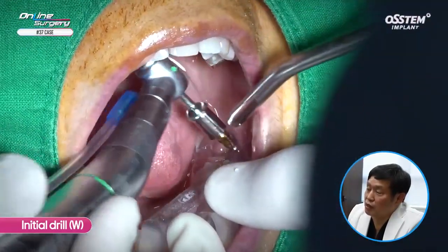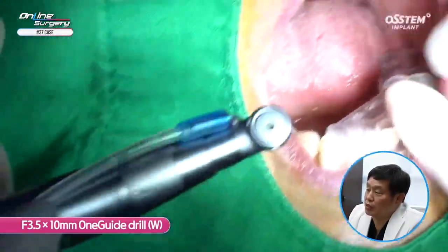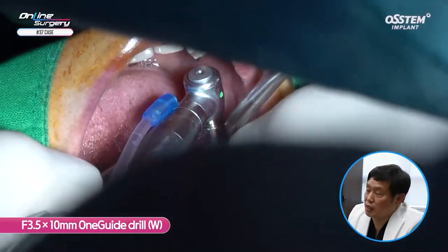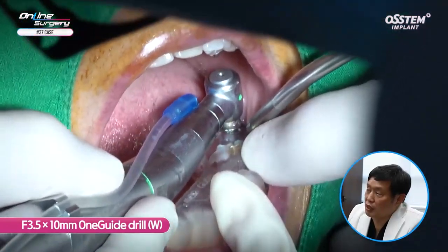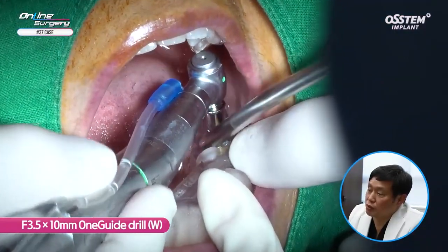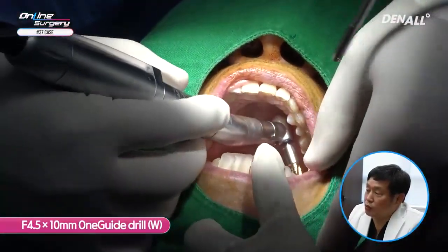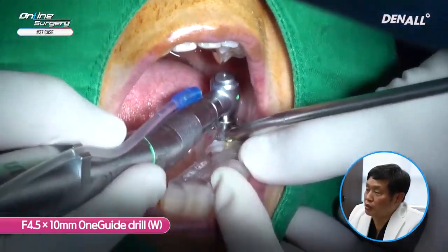Full length drilling is done next. A 3.5 by 10 mm OneGuide drill is used full length. This is to be able to get sure and stable drilling based on the double contact concept of OneGuide. Because there's sclerotic change on the bone, I did not use 5.0. I use a 4.5 once again. Full length drilling is done.